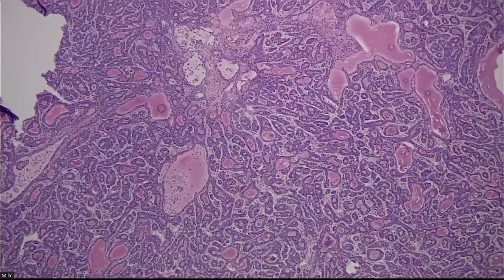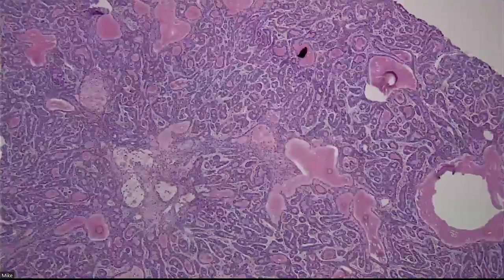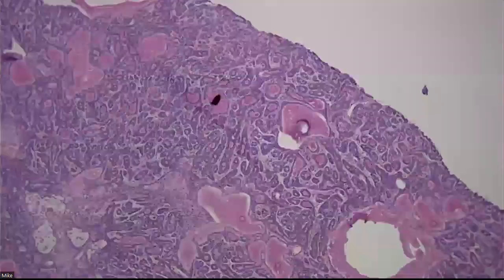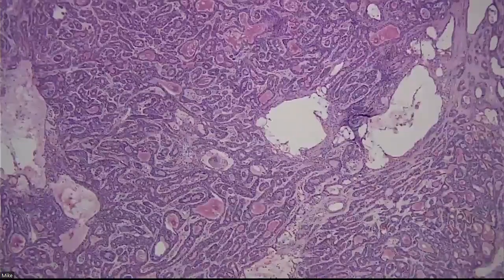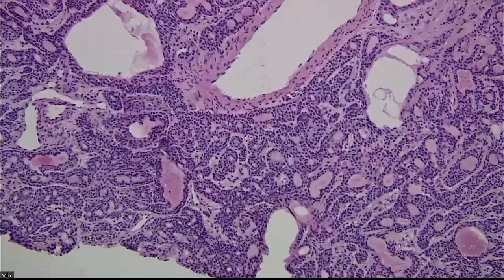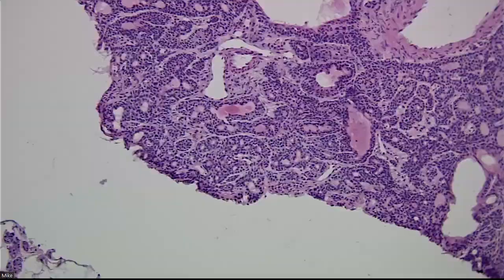Yeah, I think you're getting nice widening between each of the tubuloductal structures, maybe because of edema or ice crystal artifact, but you're getting separation of the tubuloglandular structures. Yeah, so I was like, is that desmoplasia on frozen? But then when I look at the permanent, everything looks so squashed. Right, so versus here, that background probably is some of that fibrocellular, like S100 stuff.